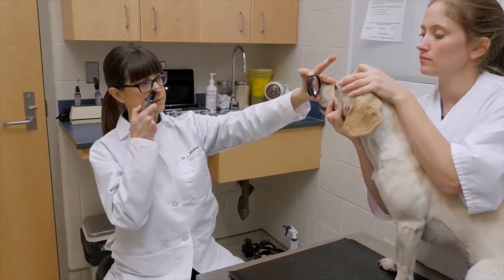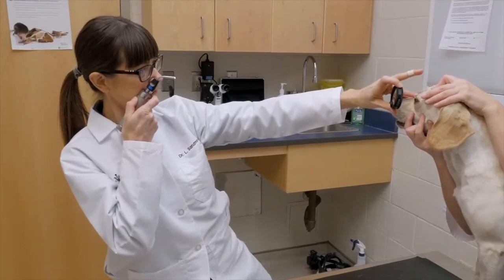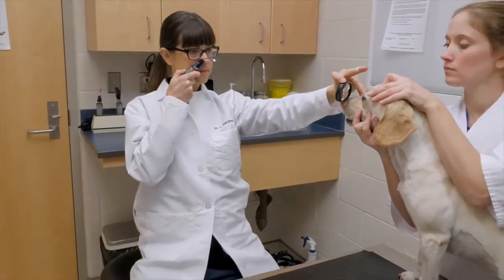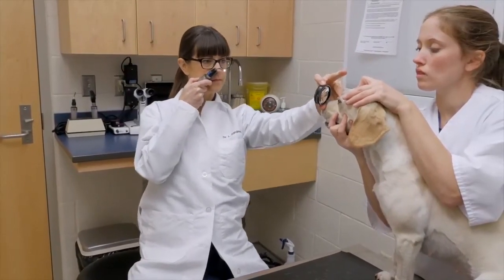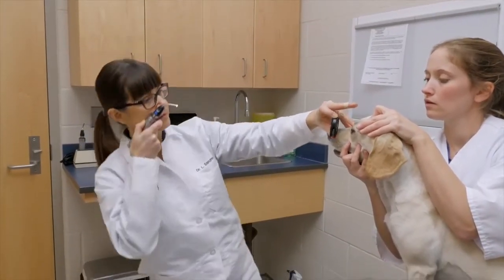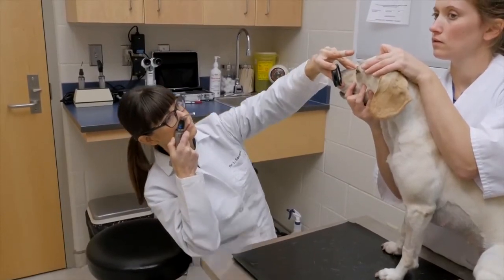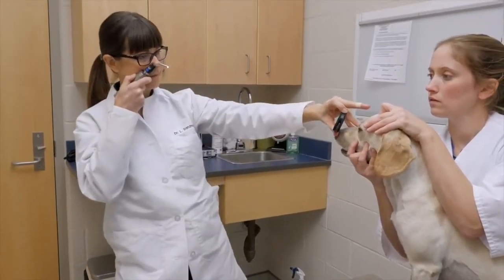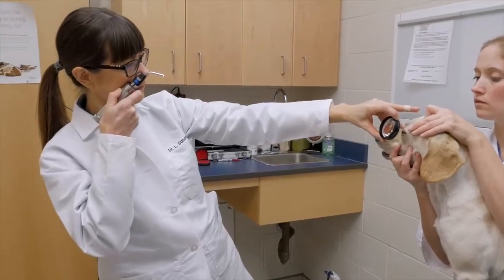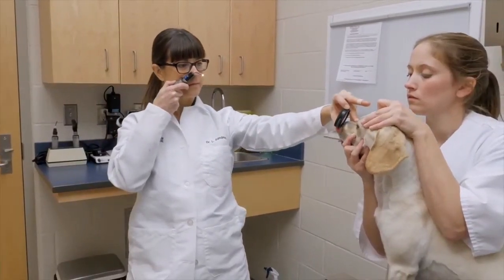To fully examine the fundus, the examiner needs to learn how to slowly move laterally, medially, dorsally, and ventrally, all while maintaining complete alignment of the light, lens, and pupillary aperture. Navigation with indirect ophthalmoscopy is usually the biggest difficulty while learning the technique, as one has to move opposite the view desired.